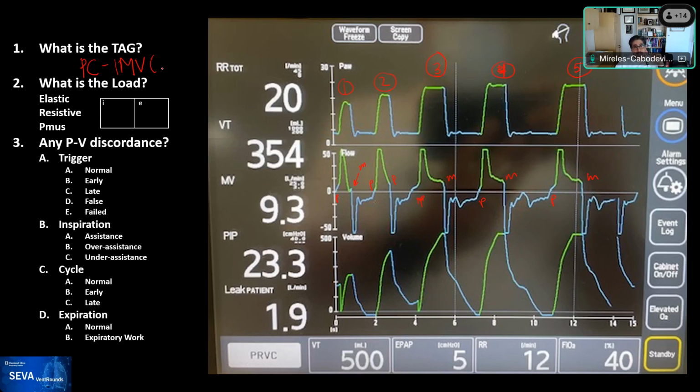Alrighty, and then the type of sequence that we see here is, we're seeing some spontaneous breaths, and if all of them are patient triggered, then this is definitely not type 2, because we would expect all of them to be patient cycled under those circumstances. However, there's a trick here that I'll show.